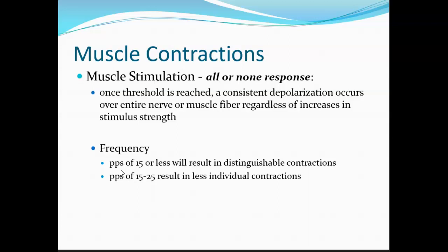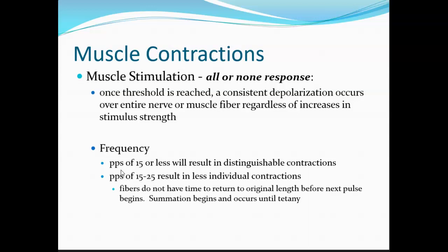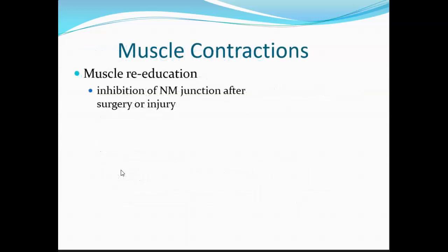It's being bombarded by all these electrical pulses. So now what happens is you get twitch, twitch, twitch, twitch, twitch, contract, and it just holds until the electricity goes away. All right, I'm getting excited again. So that's on there. Make sure you have a good idea of that.